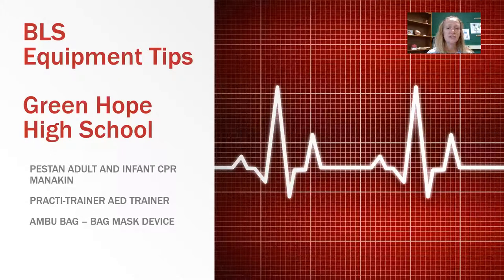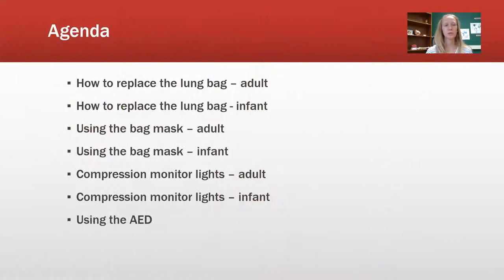The purpose of this video is so that you can get familiar with the equipment that we have here at school to do the CPR training. We have the Prestan Adult and Infant CPR mannequins, the Practi-Trainer AED Trainer, and the Ambu bag for the bag mask device. Our agenda covers how to replace the lung bag in the adult and infant, using the bag mask, the compression monitor lights, and then using the AED.